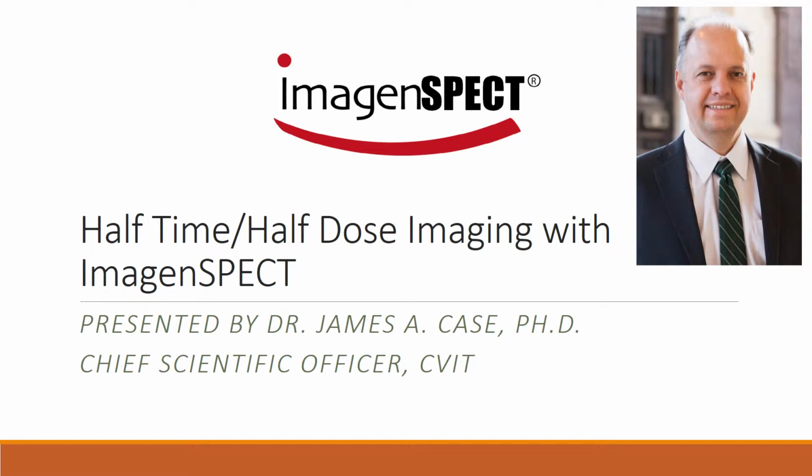This tutorial is designed to give you an understanding of how ImagenSPECT works and to improve image quality and enable half-time, half-dose imaging in SPECT.